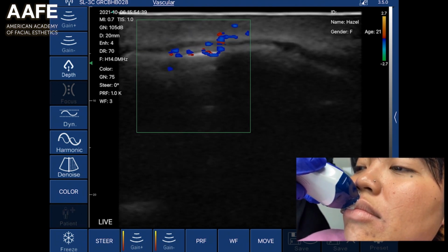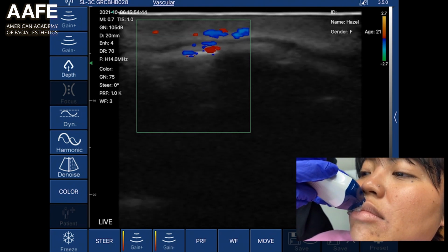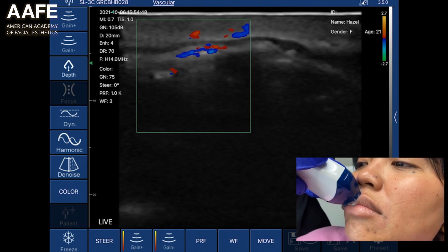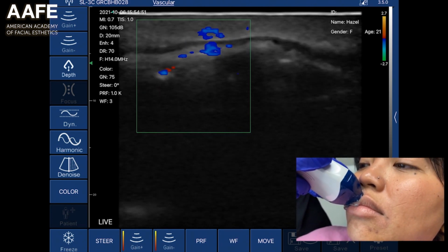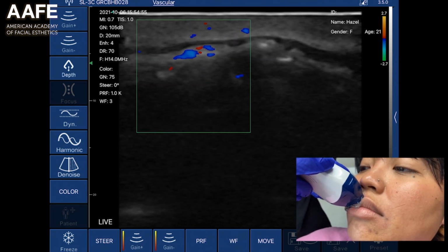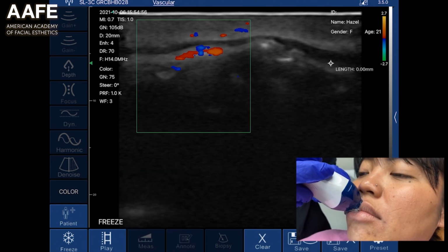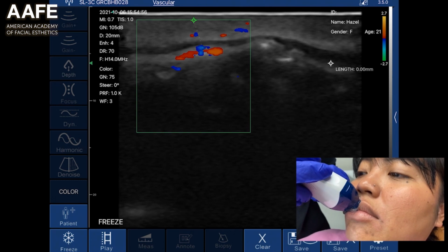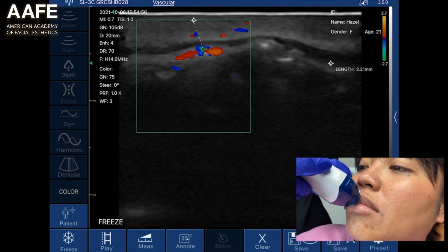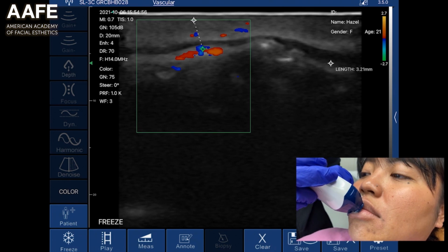If you see a lot of activity right on top of the white thing, hold still as much as you can there, Lauren. If you see it right on top of the white of the teeth there, you can see, and some of the other things are artifacts, but that is fairly deep. So we're going to freeze this, and here we go. That is perfect. And we're going to measure from the top, from the lip and down, so we know that we are about 3 millimeters away from that, and even a little bit more because I didn't get to the actual top of the lip there, and that is really good.